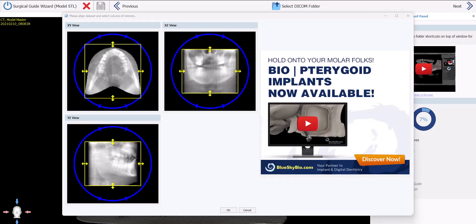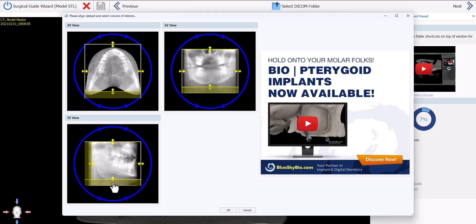We are now being prompted to select the relevant field of view. You can do so by grabbing and dragging with your left mouse button any of the yellow border frames, dragging them inwards to define the field of view. By reducing the field of view we're maximizing the relevant data within the future views and reducing the processing power needed. Make sure to include all relevant data for planning purposes, then click OK.